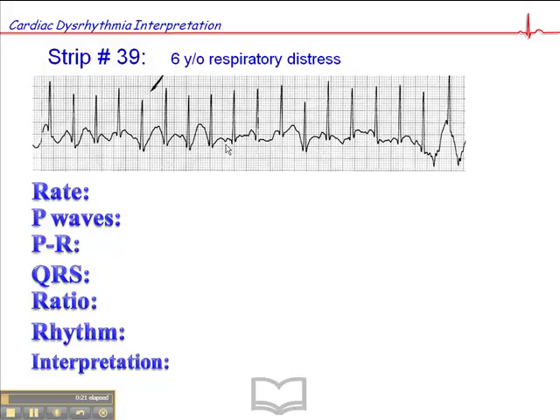This is a child who's distressed, and there was quite a bit of artifact. Our objective is to try to get a clear tracing — try to get the child to stay still, or try to put the electrodes somewhere away from large muscle mass or an area of the body that's not moving so much. But it can be a challenge, especially when you're dealing with a child who's crying and upset and distressed, and that was the case here.